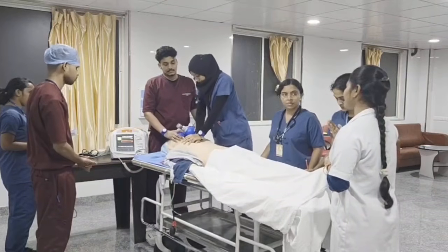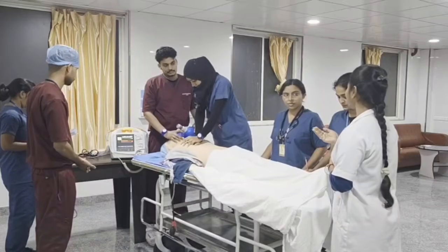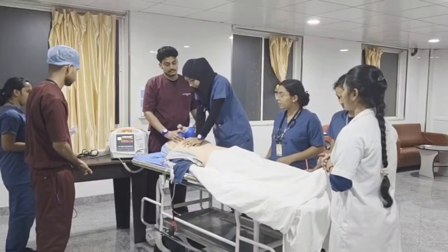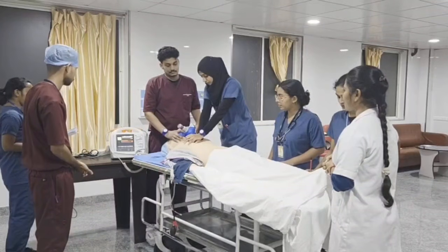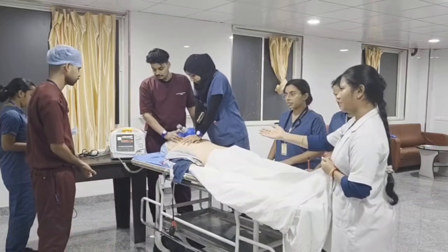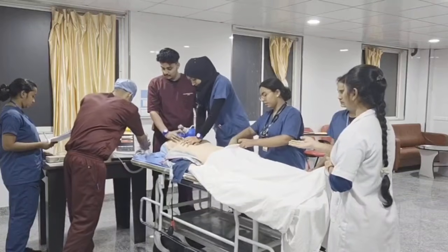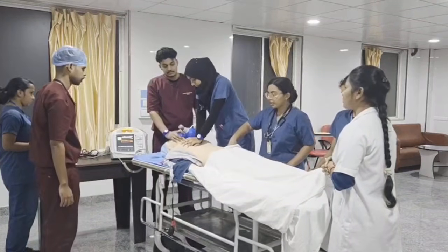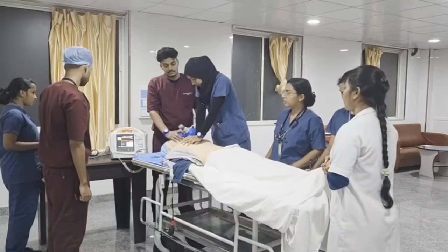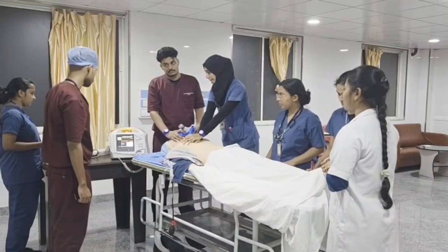So you can prepare the next dose of epinephrine and give it at an average interval of around 3 to 5 minutes, okay? Epinephrine preloaded. 15 seconds more. You can pre-charge the defibrillator with the maximum joules. You can pre-pulse check over the femoral artery. Pulse is checked. Pulse is absent. Okay. Shock is charged. Okay, thank you.